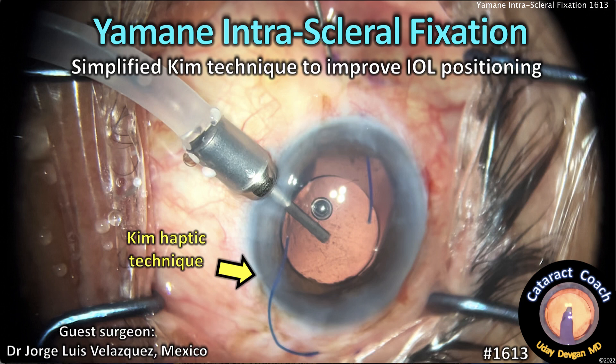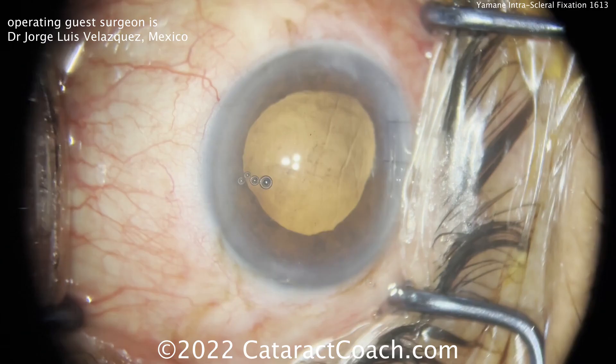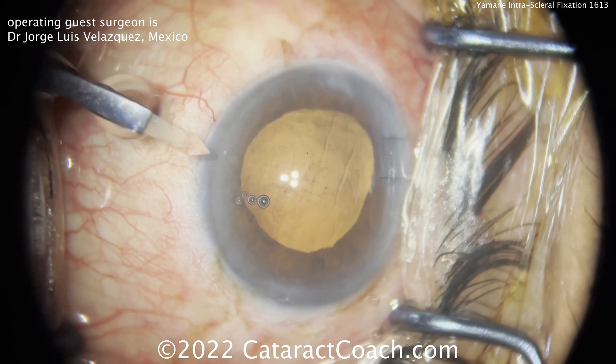CataractCoach.com — Yamane intrascleral fixation, this time using the Brian Kim technique to improve the IOL positioning.